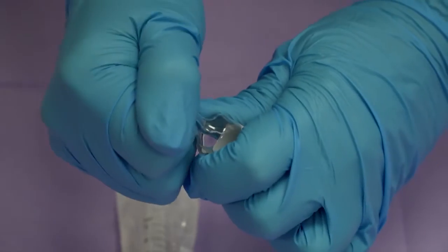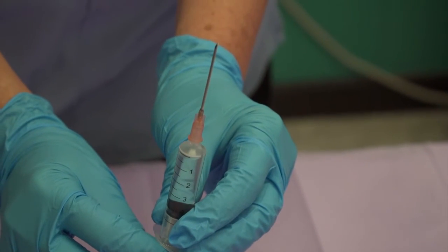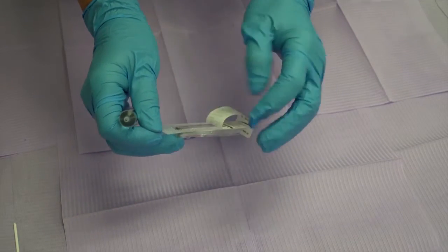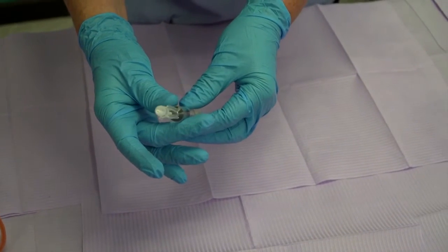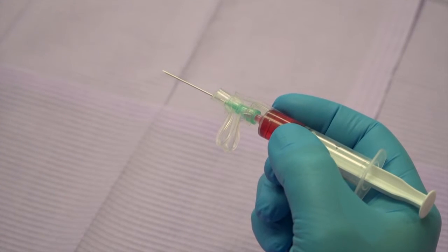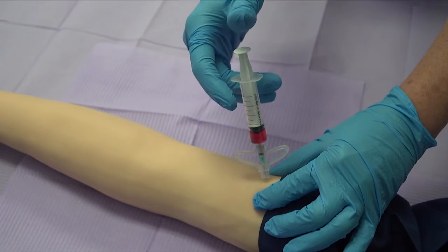Withdraw the medication with a blunt fill needle. Remove any air bubbles from the syringe. Detach and appropriately discard the blunt fill needle, then connect the Reflex Safe passive safety needle. Hold the syringe in normal position for the procedure and make the Reflex Safe Needle ready for use by holding the syringe near the bottom of the syringe barrel while pushing the protective end cap towards the syringe. Hold the silicone wing with one finger against the side of the syringe with the hand in a darting position. Dart the needle into the selected muscle for IM injection, then remove your finger holding the silicone wing to allow the passive safety mechanism to be available.